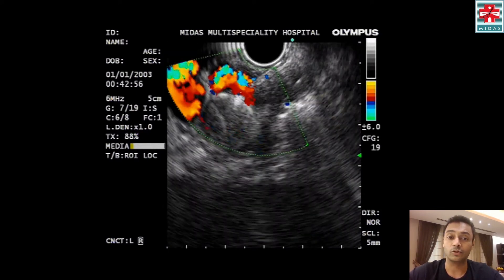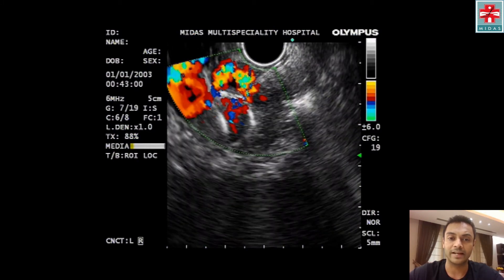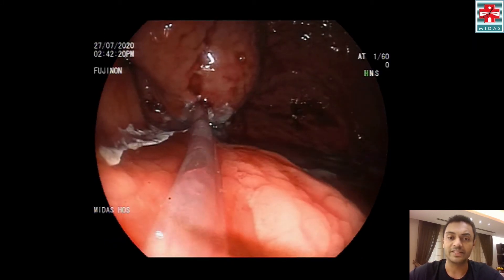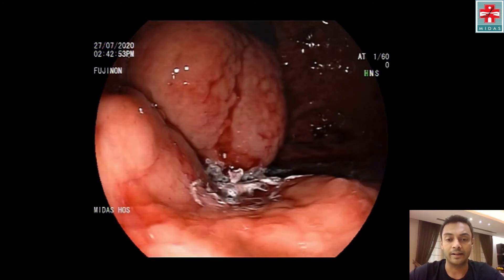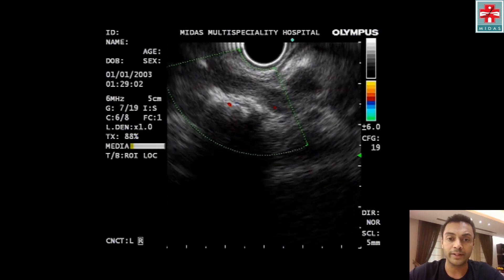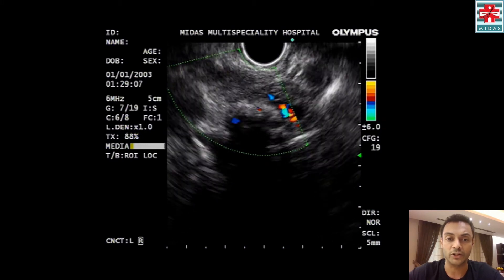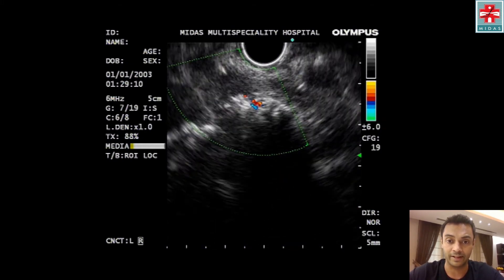The coils create a thrombus inside the fundal varices, and on Doppler you can see there's a slight reduction in flow. We supplemented this with endoscopically guided glue injection — there is some extravasation of glue — but following this, endosonography showed almost complete reduction or absence of blood flow in the gastric fundal varices.